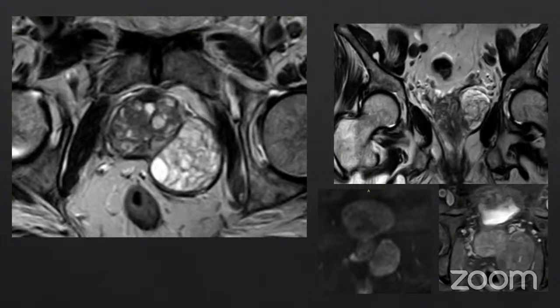So what do you think this large nodule which is there, it is arising from where, inner zone, where it is and what it is exactly? So I think we have got the answer, and this time we can give it to Dr. M. Chandramouli for exophytic hyperplasia.